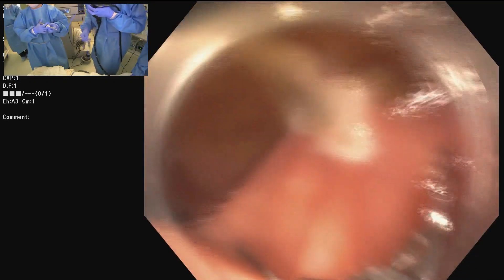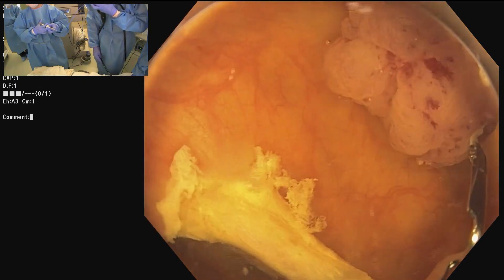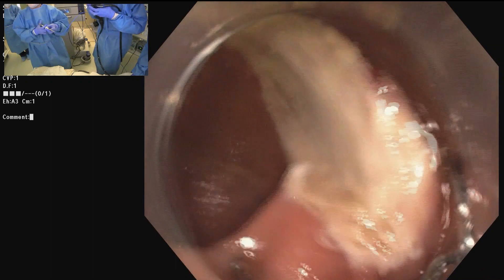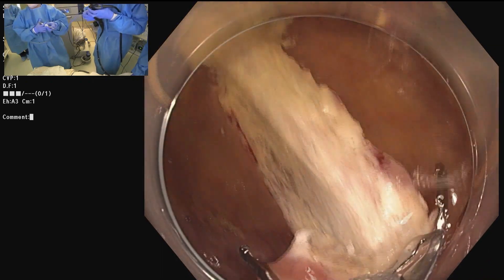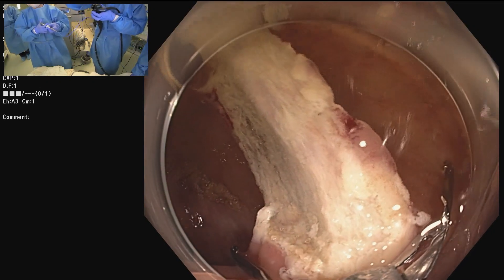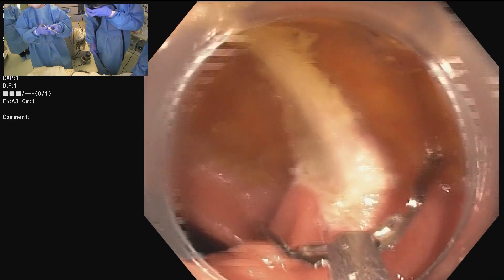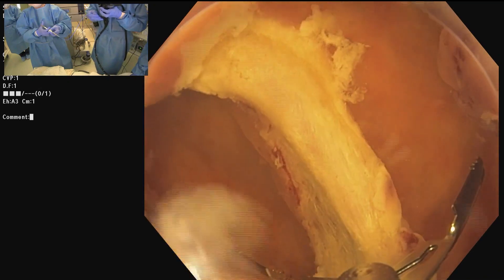I've never done it, and our recurrence rate is under 5%, so I don't see a need. Our inspection underwater with magnification and near focus is so reliable. The dots are important unless the lesion is so obviously polypoid that you can safely place your snare around the perimeter. It has a lot to do with my approach of always attempting en bloc resection.